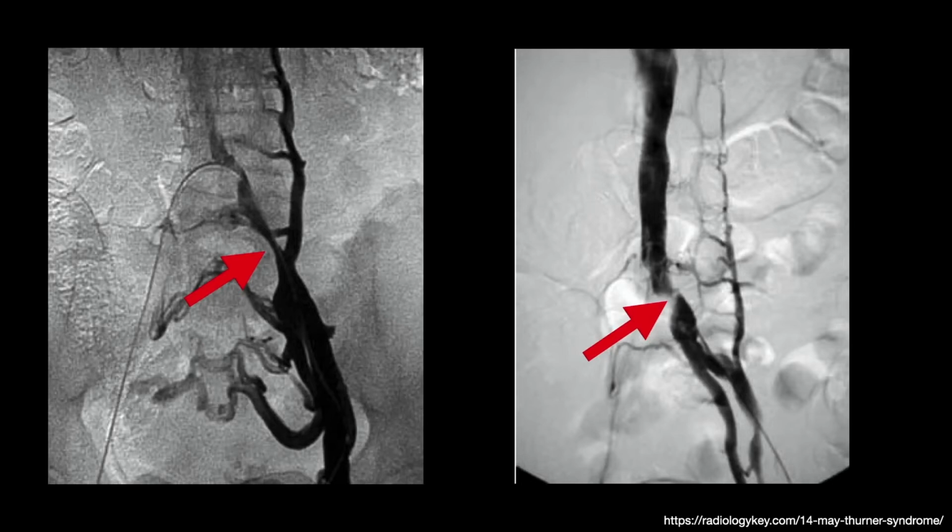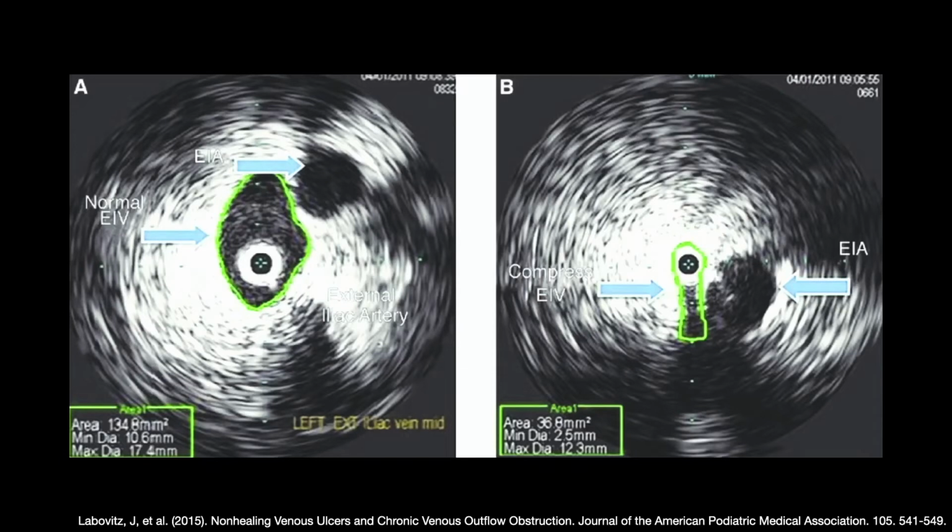Now, it's actually a pretty good study, but the downside is if you just shoot one view, you might actually miss this, right? So you need multiple views evaluating for it because you can get that pancake squashing effect of the venous compression. But you can find stenosis here, and they actually say if you have greater than 50% stenosis, it may be considered sufficient grounds to provide therapy for symptomatic relief. So it's certainly a test that you may run into.